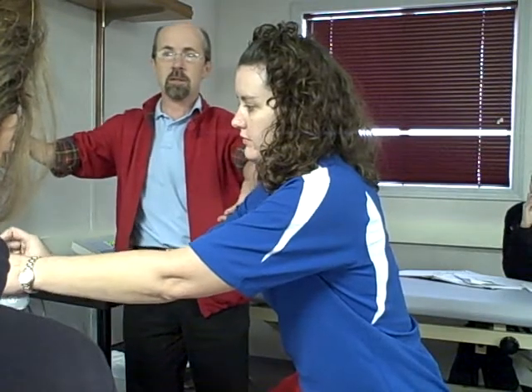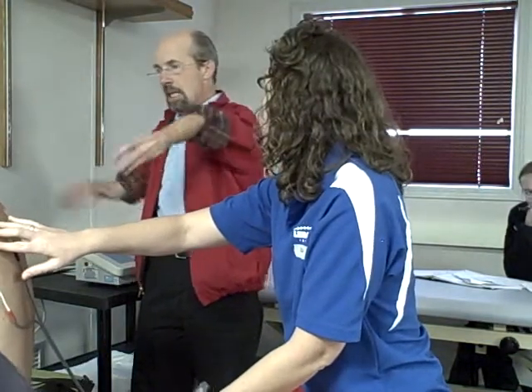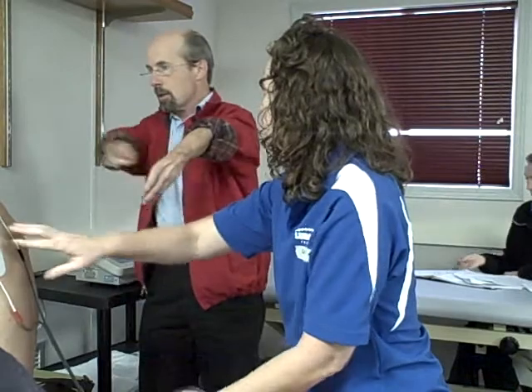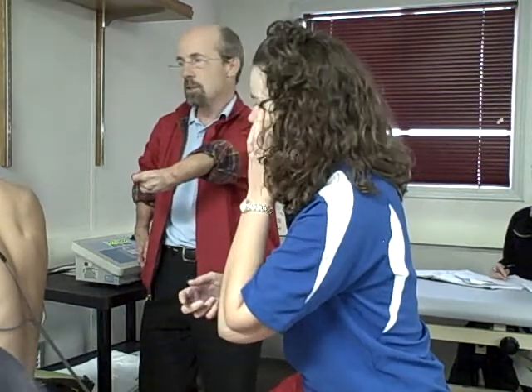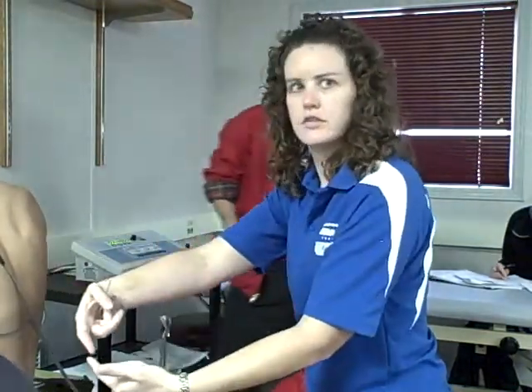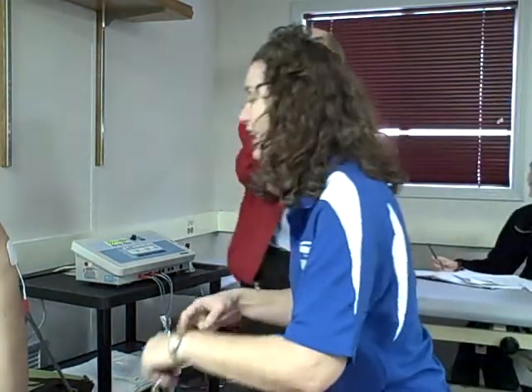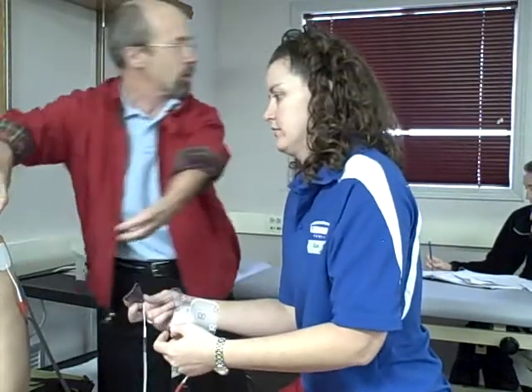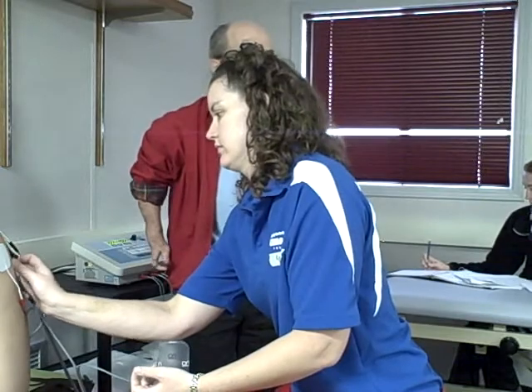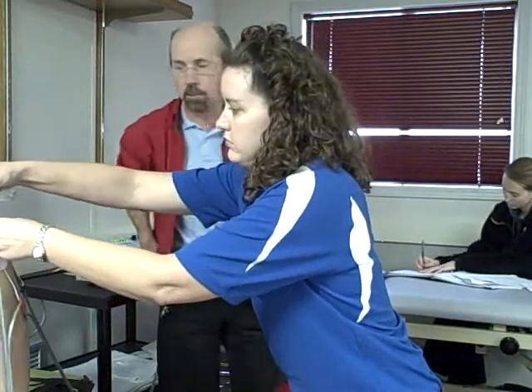And do keep in mind something else. The distance between the electrodes does affect the depth of the current flow. The distance between the two electrodes of any one given channel does affect the depth of penetration. The further apart, the deeper it goes. That's my understanding: the further apart the electrodes are, the deeper the current goes. So just keep it in mind. I'm not saying it needs to be a primary concern. I would say an average of 4 to 6 inches between the electrodes, if possible, is good. Otherwise, you don't have any goal in terms of depth of penetration.